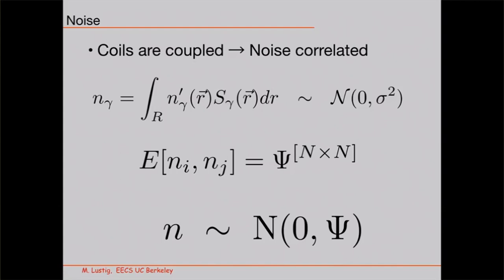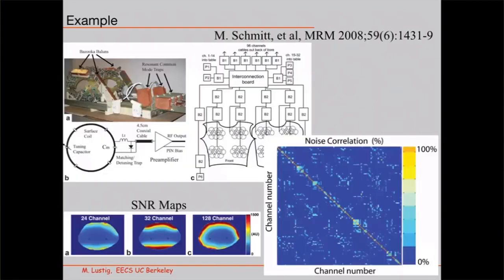Okay. Yeah. So the raw k-space is Gaussian. If you take an inverse Fourier transform, because it's unitary, you actually don't change the statistics by that. That's still going to work. But if you take a magnitude operation, then that's a problem. Okay. All right. So this is from a paper, I think, from MGH, and this is a multi-channel array here.